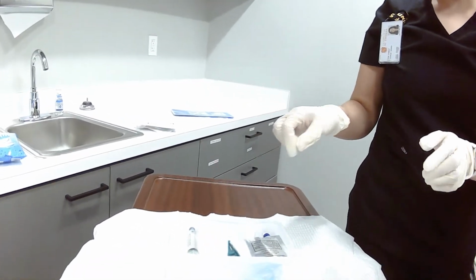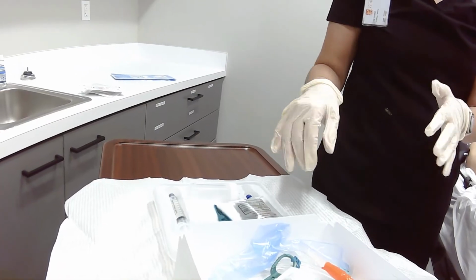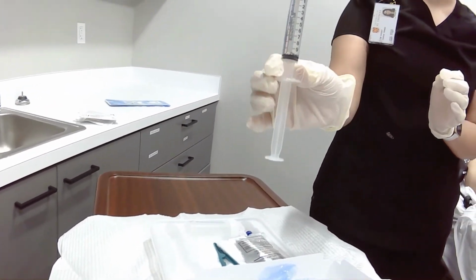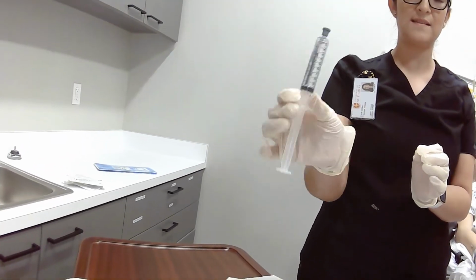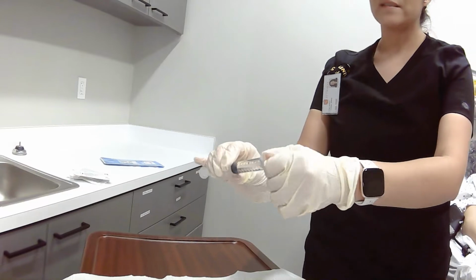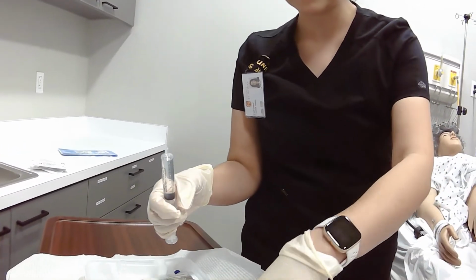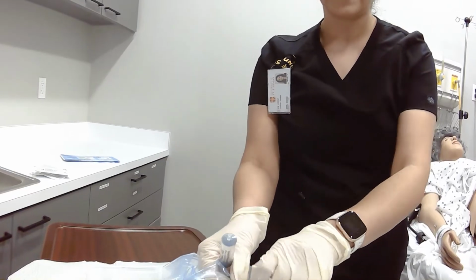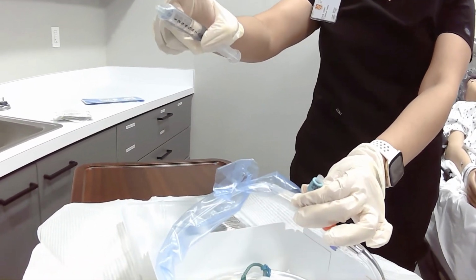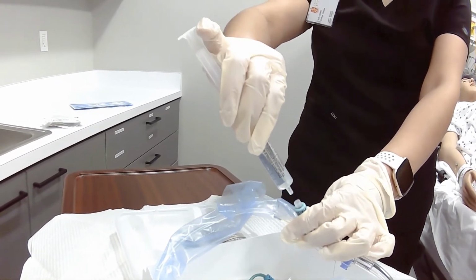So now I'm going to get ready to prepare the rest of my tray. You're going to see that you're going to have a 10 ml or 10 cc sterile water syringe. This is going to be used to fill the catheter balloon at the tip of the catheter. And you're going to connect it, make sure this is not contaminated. Now you don't touch it with your gloves or anything, even though you are sterile.